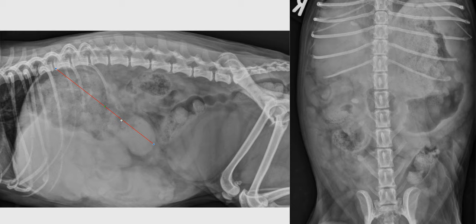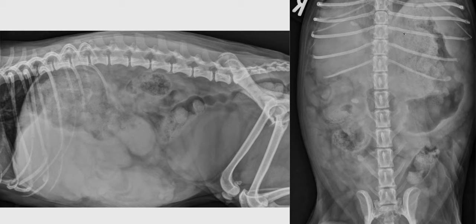When we see this finding, that indicates a mass effect coming from the cranial ventral abdomen. On the ventral dorsal projection, we can see that the stomach is also displaced, but in that case it is displaced mostly to the left, indicating that the mass effect is probably coming from the right cranial abdomen.